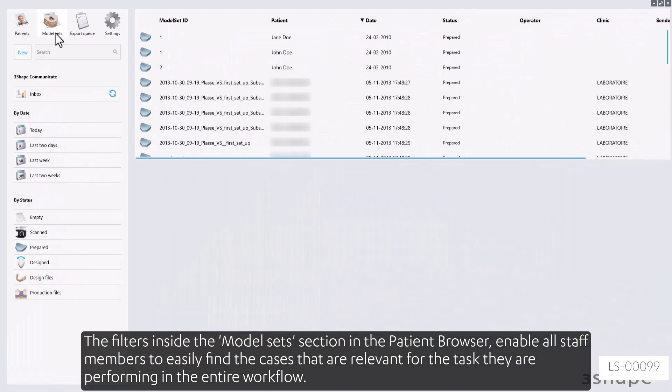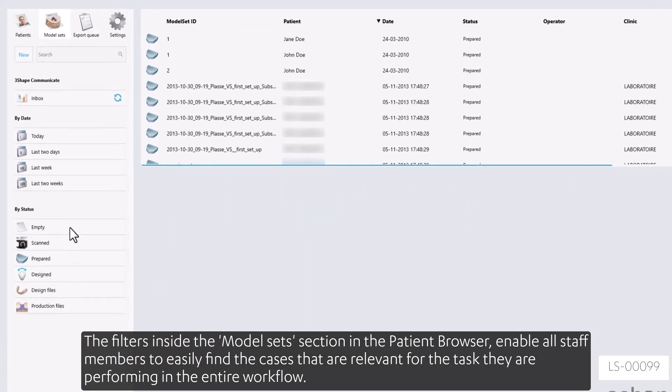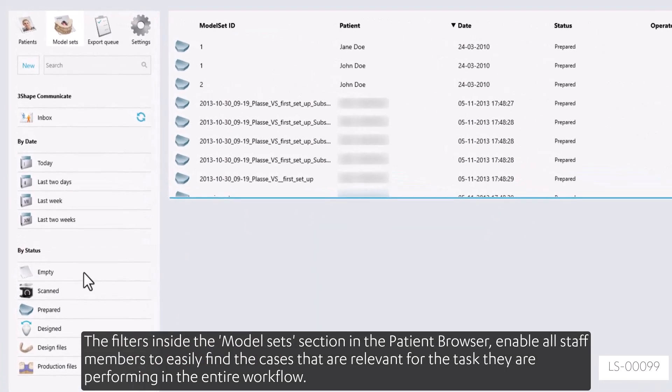The filters inside the Model Sets section of the patient's browser enable all staff members to easily find the cases that are relevant for the task they are performing in the entire workflow.